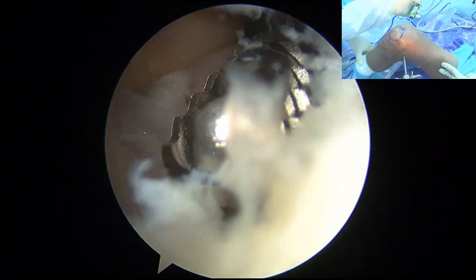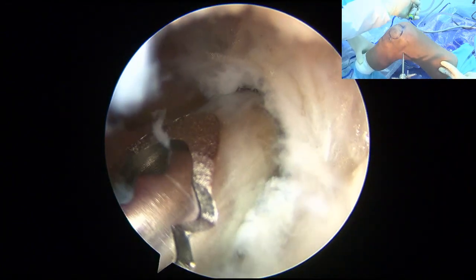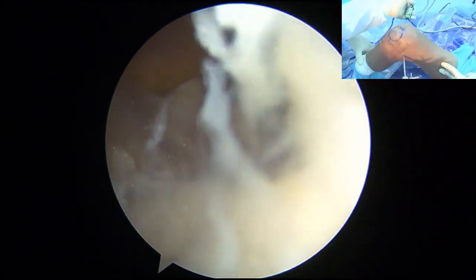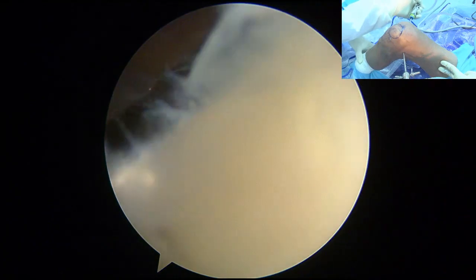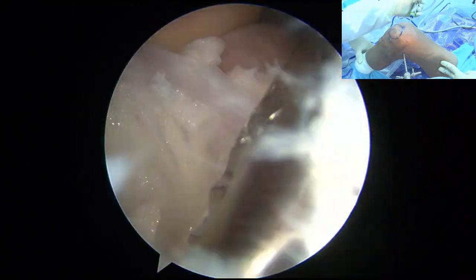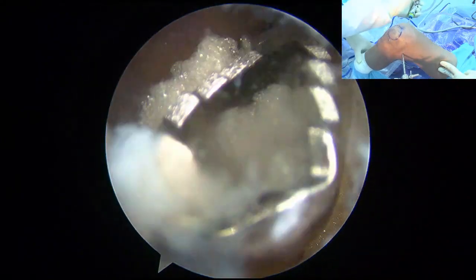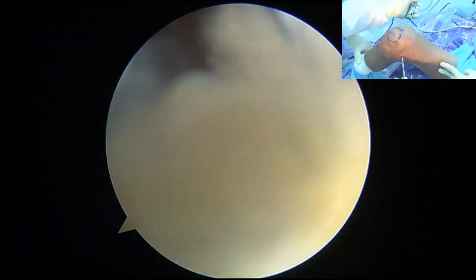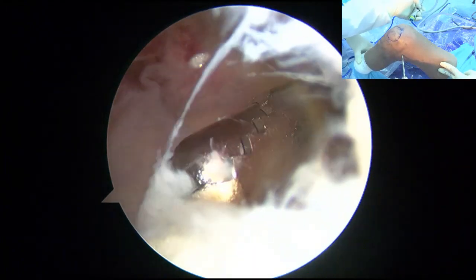Okay, so now you just follow your track. Keep in this track, very important. Do not get out of this track because the vessel is on your right-hand side. The vessels and soft tissue are on our right, so all our operations must follow the soft tissue tunnel we just opened. Your movement is just up and down.